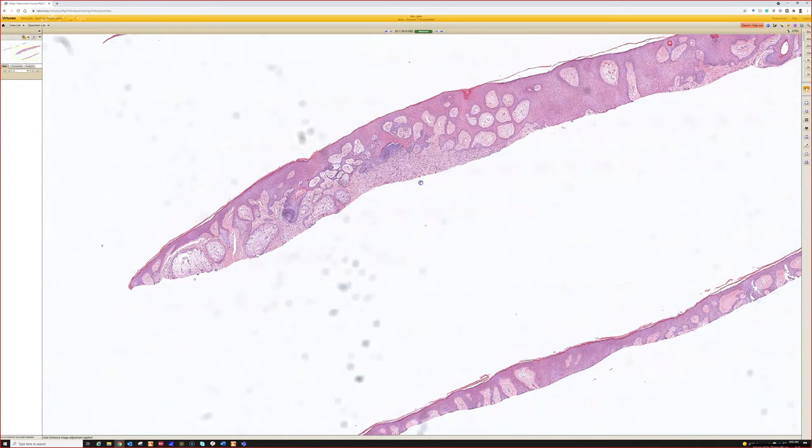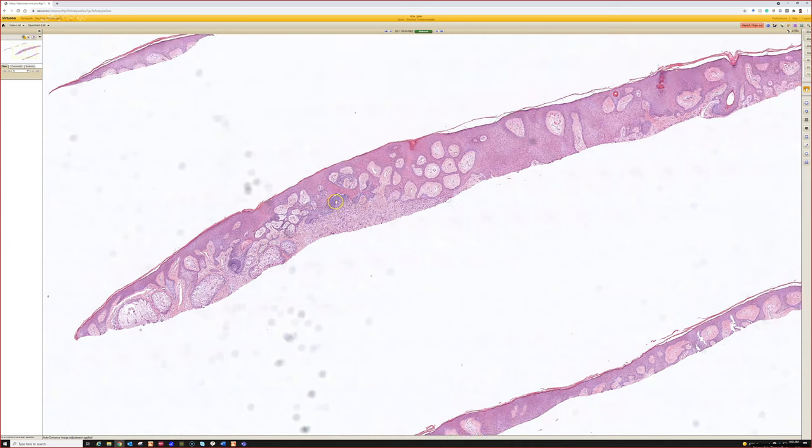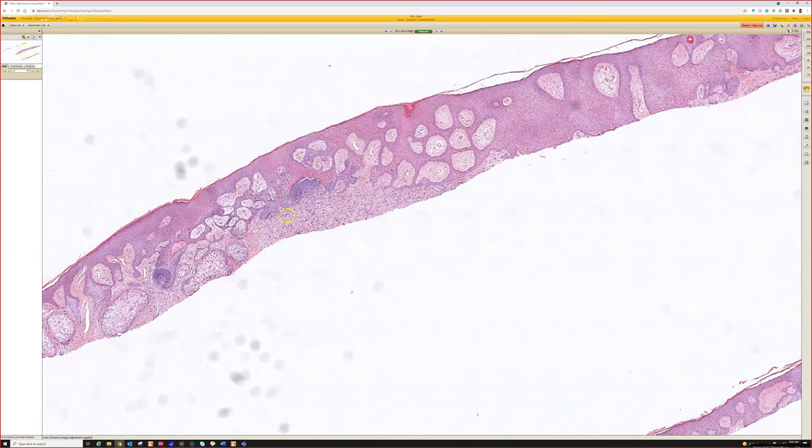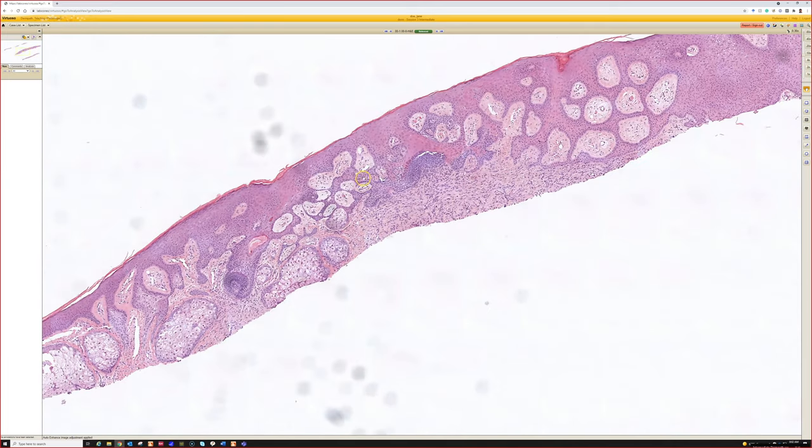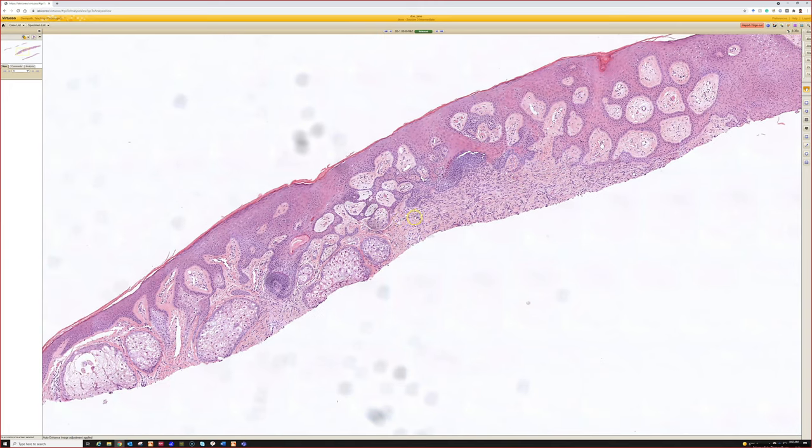Finding the spindle cells and seeing it pressing right up against the basaloid structures is helpful for knowing it's a benign basaloid follicular induction over a dermatofibroma rather than basal cell carcinoma. I have seen a couple times of true basal cell carcinoma growing right over or next to a dermatofibroma.